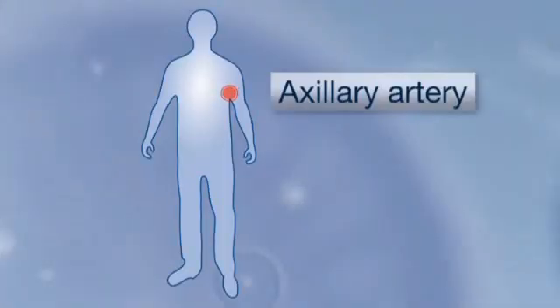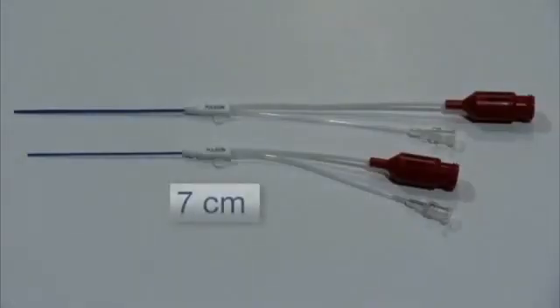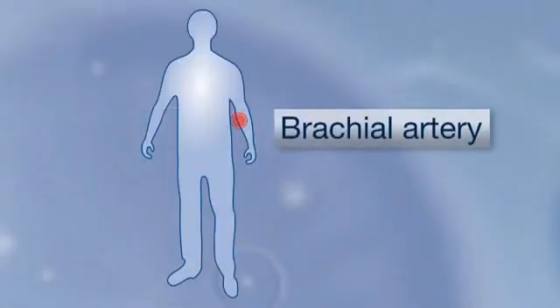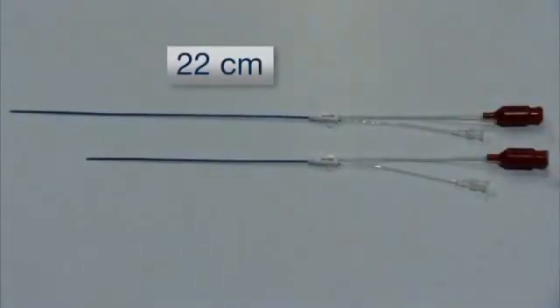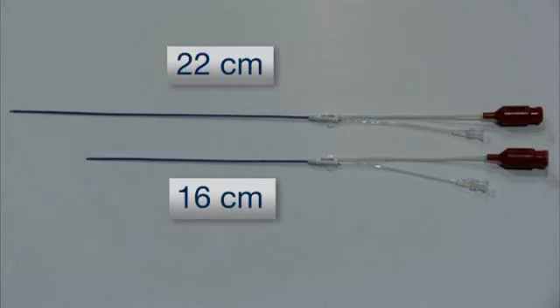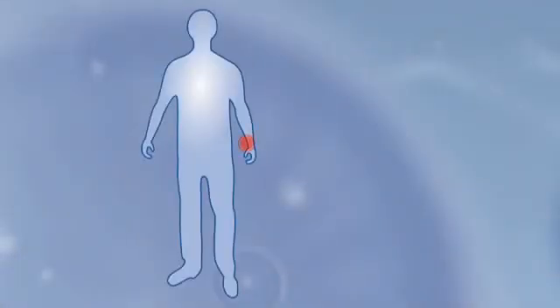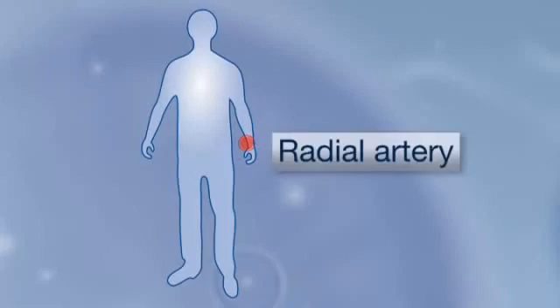You can also insert the PiCCO catheter in the axillary or brachial artery. Catheters with a length of 7 or 8 centimeters are suitable for the axillary artery. You can also insert in the brachial artery at the elbow, and the appropriate catheter is 22 centimeters long. Or if you enter it at the level of the upper arm, you can use the 16 centimeter. For certain indications, a special PiCCO catheter can be placed in the radial artery, for instance during an operation.